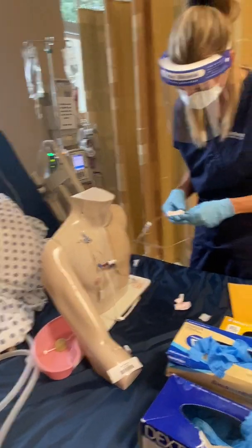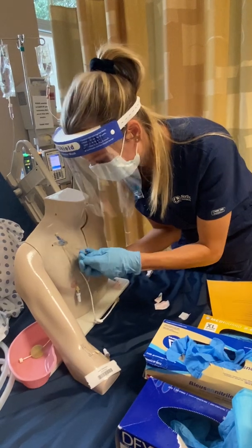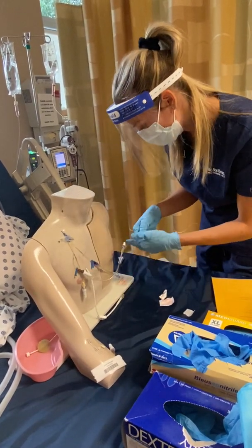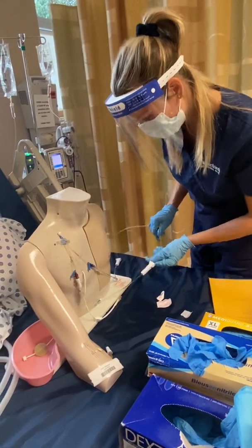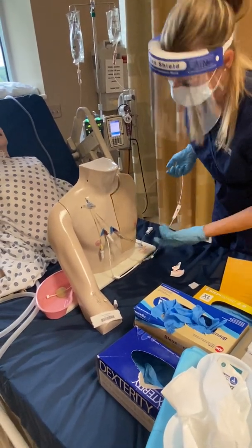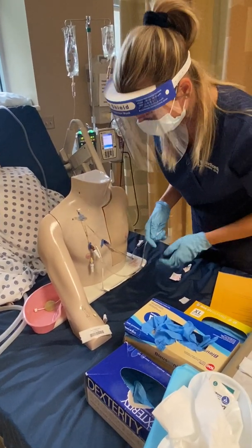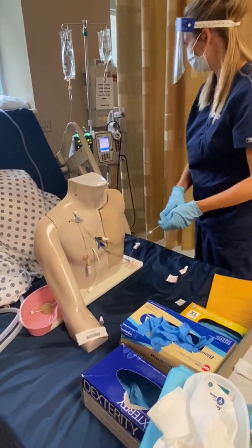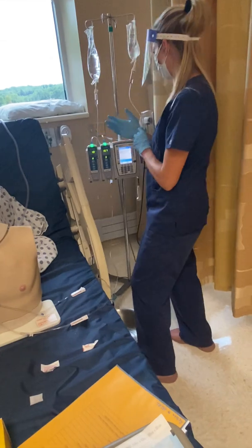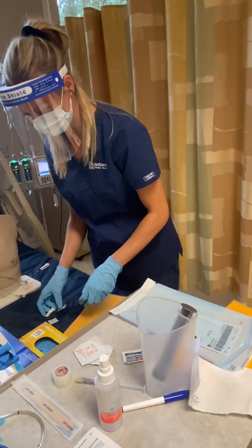Okay, so I'm going to get... All right, just make sure that this looks all good. And I know that I already have gloves on, but I would be wearing gloves while I was doing this, and I think I already said that I had gloves on before. Just make sure that this all looks good and it's running and looks like the pump is going, so should be good to go with your bolus now, Jane. Okay, all right, so I'm gonna take my gloves off and wash my hands up.